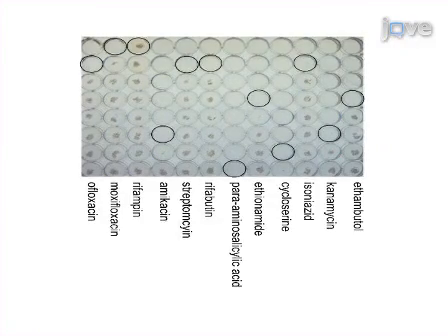The resulting data indicate the minimum inhibitory concentration for each drug tested, and show which antibiotics the tested strain of TB is resistant to. These results aid in choosing the appropriate drug for treatment of TB.